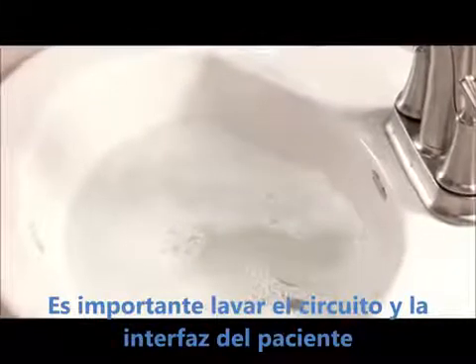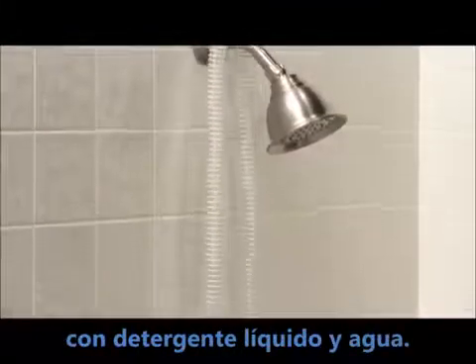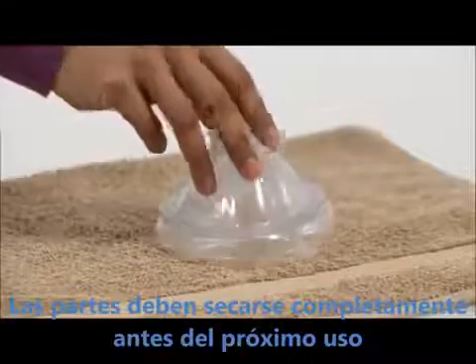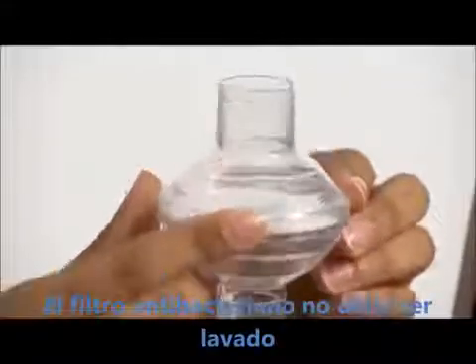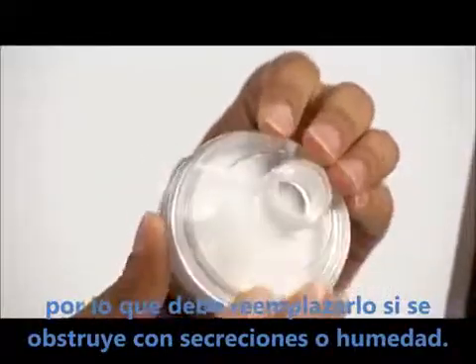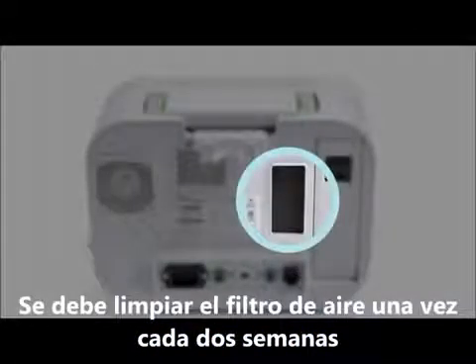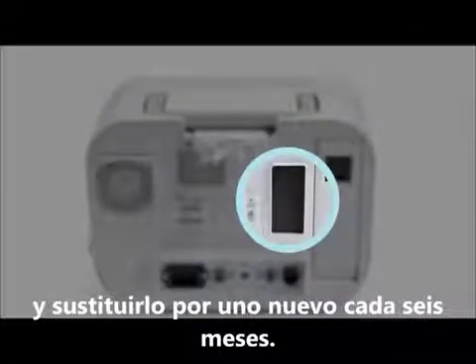It is important to wash the breathing circuit and patient interface with mild liquid detergent and water; the parts must dry completely before next use. The bacteria filter cannot be washed, so you should replace it if it becomes blocked with mucus or trapped moisture. You should clean the air filter at least once every two weeks and replace it with a new one every six months.